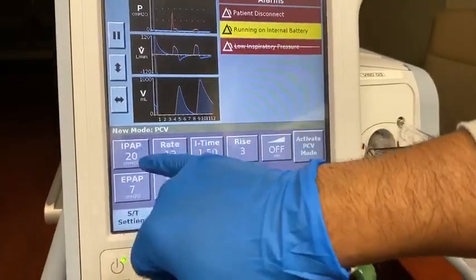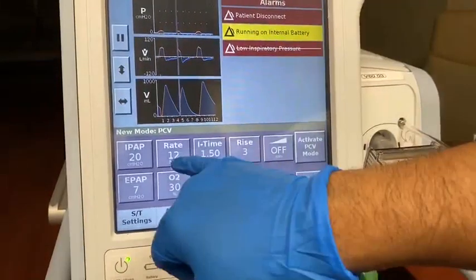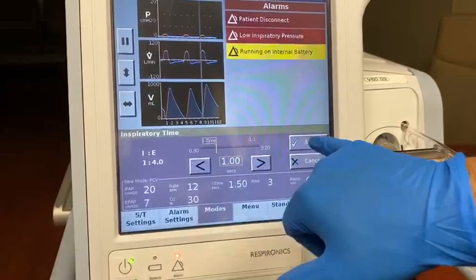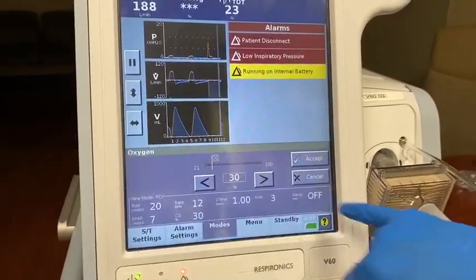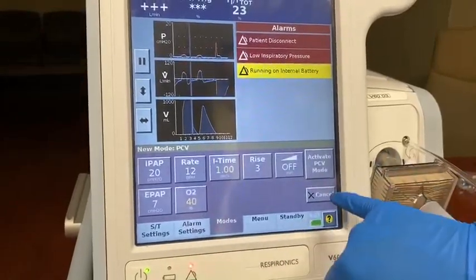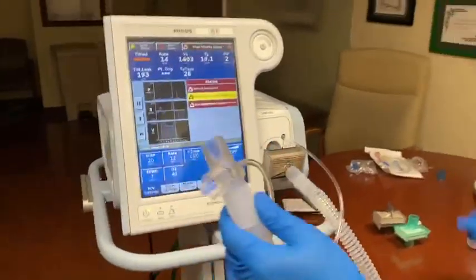Make sure the settings — the IPAP — matches what's on your conventional ventilator. The rate, the I-time, you can go back to 1 or 0.9. And once you hit accept, O2 as needed — 30%, 40%, doesn't really matter. Accept and activate the mode. You are on a classic pressure control mode.